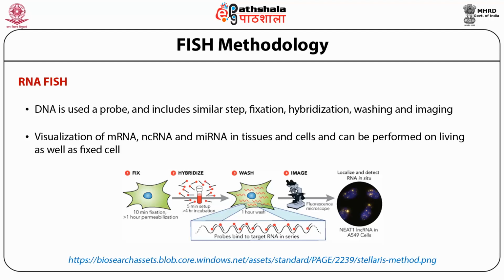In this method as well, we have DNA as a probe, and again the DNA-based probe can be made either using PCR or using the nick translation method. This entire process involves very similar steps, but we need to make sure that the fixative solution as well as the solution we are using for the in situ hybridization technique are all RNase free, and the salt strength is maintained so that RNA within the cell is not degraded. Otherwise, most of the steps, including fixation, hybridization, and washing, are done exactly as in DNA FISH.